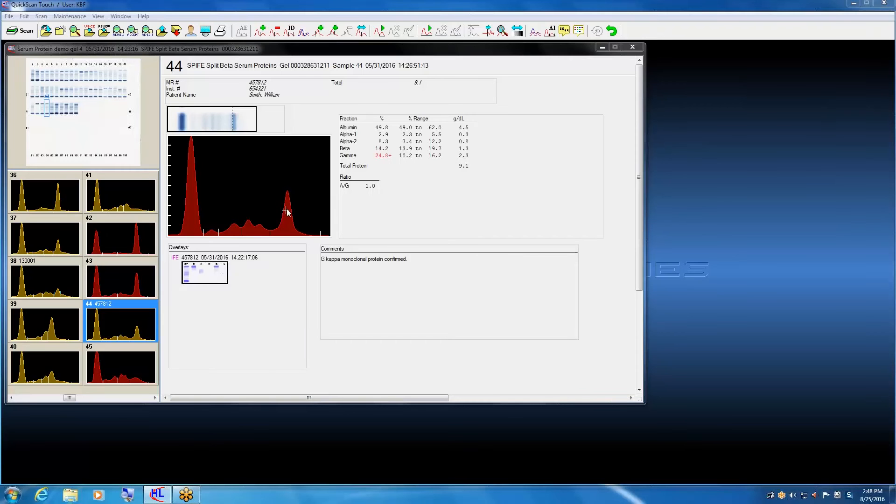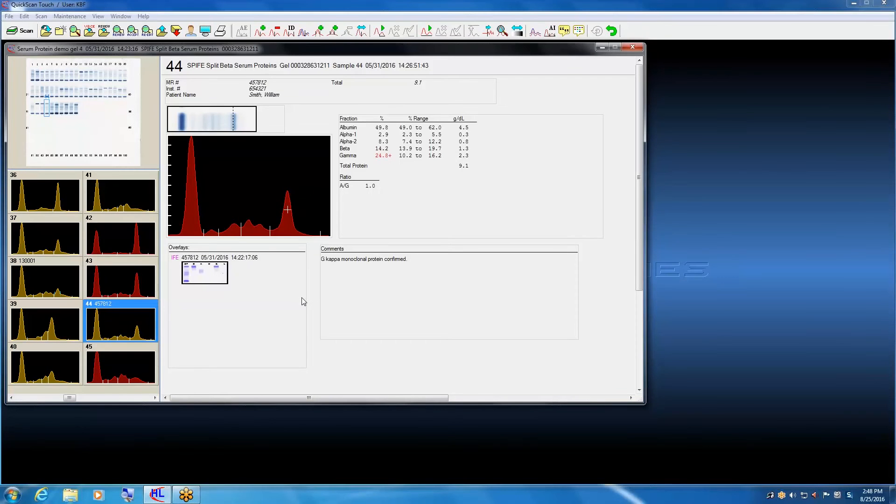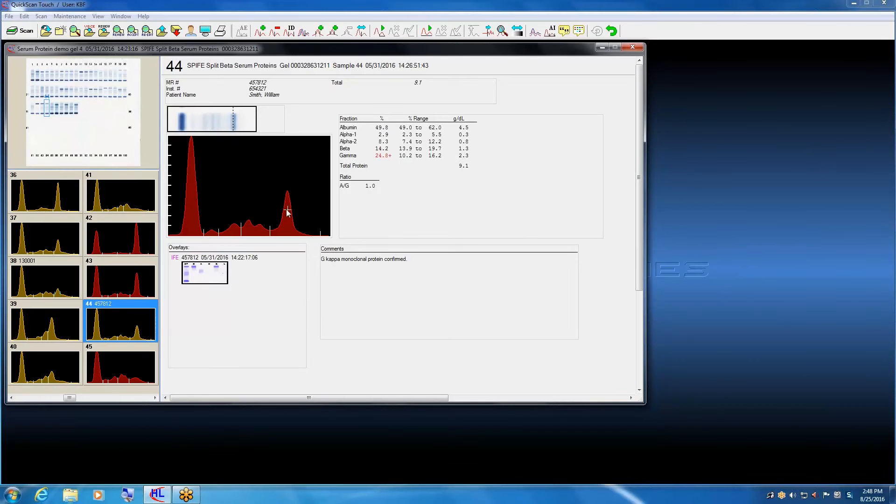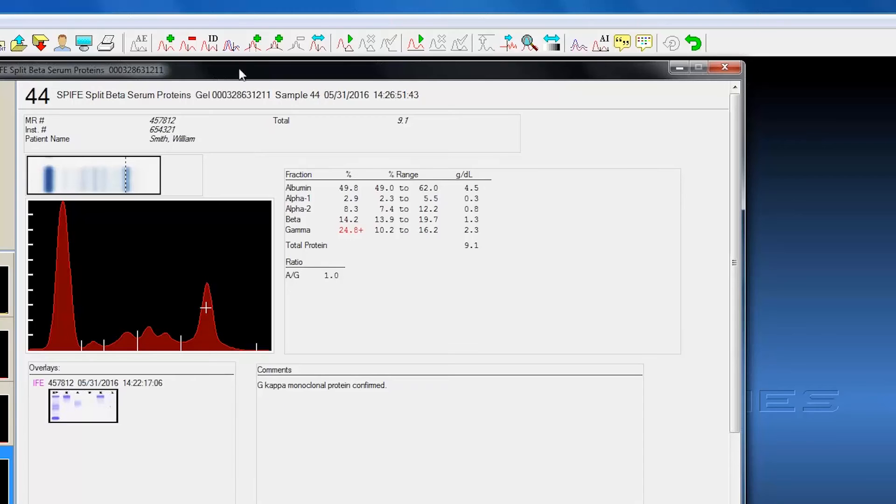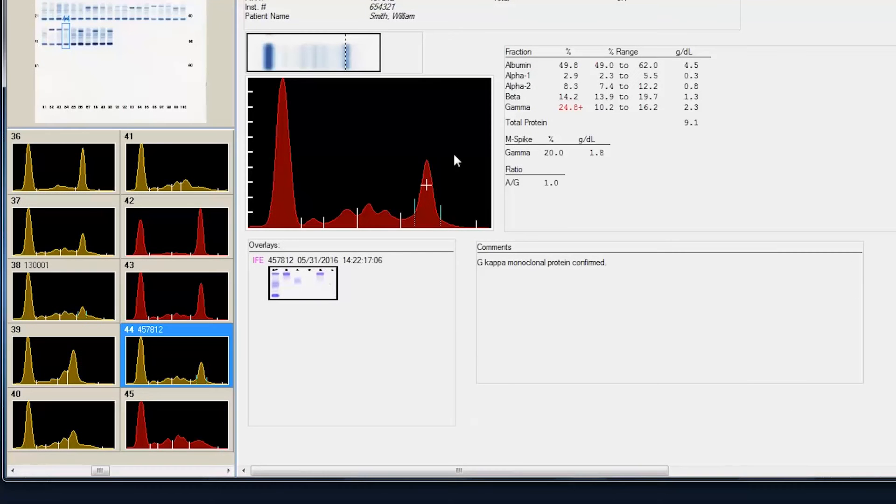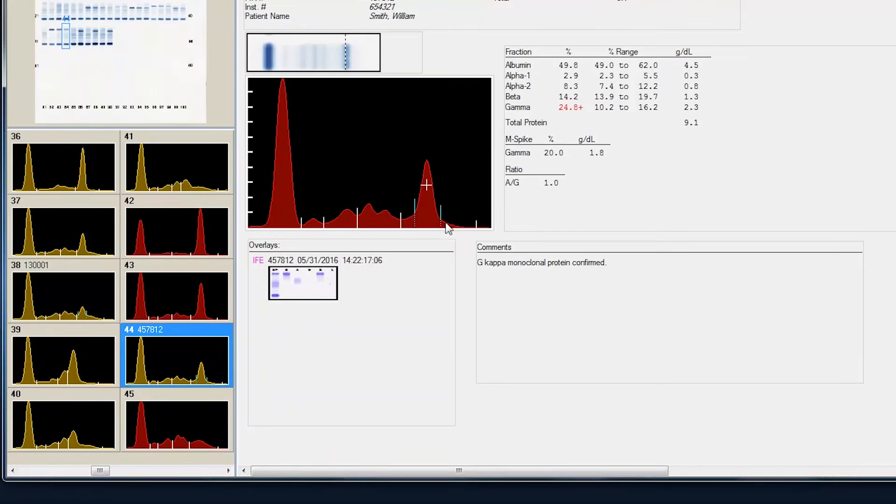First feature I want to show you is the ability the computer has of delineating the monoclonal protein itself. All the operator has to do is indicate where the monoclonal protein sits, reach right up to an icon, and based on an algorithm in the software, it determines where these fraction delineations or the M-spike delineations should be and displays that quantitation.